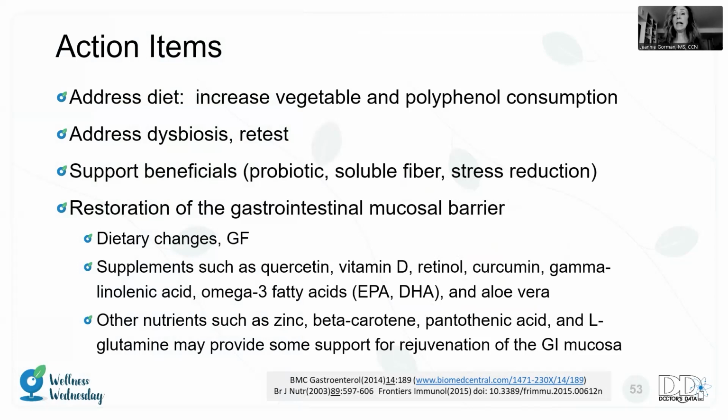But the microbiology combines them both, and you can get a status update on how the cultures are doing from a bacteriology profile and a yeast profile. So that would be the best one. You can also tie in some of the markers from the stool chemistries as add-ons or separate a la carte items, just depending on the profile that you're choosing, to recheck, say, the secretory IgA or the lysozyme, just to see if that's gone in the right direction.